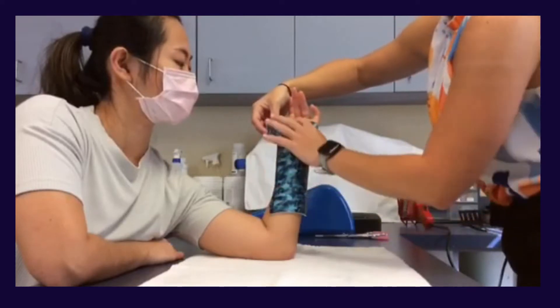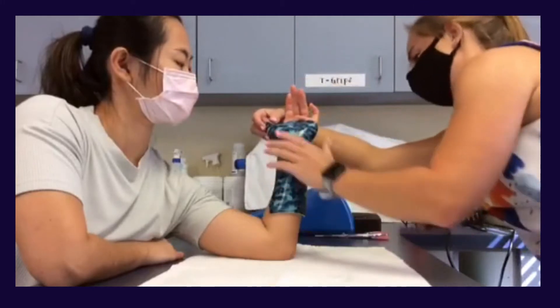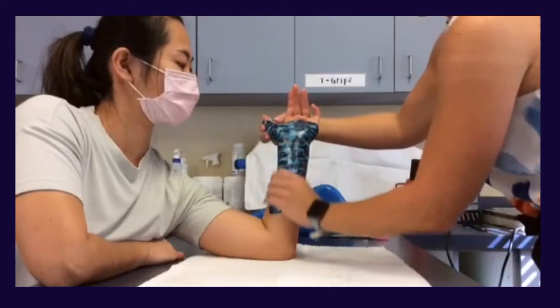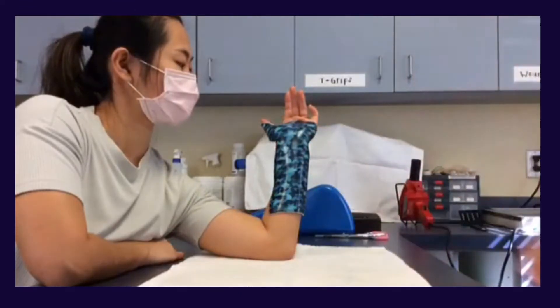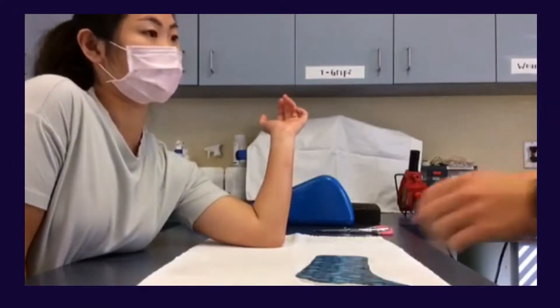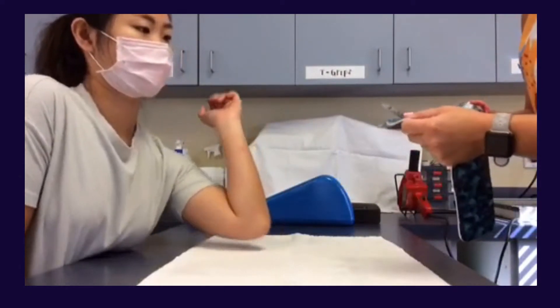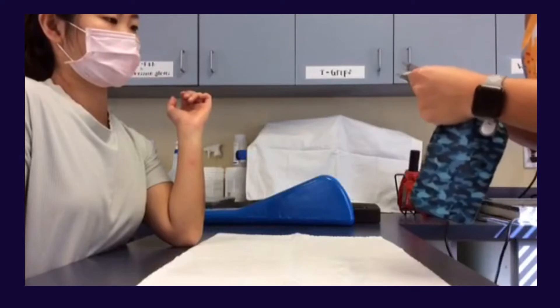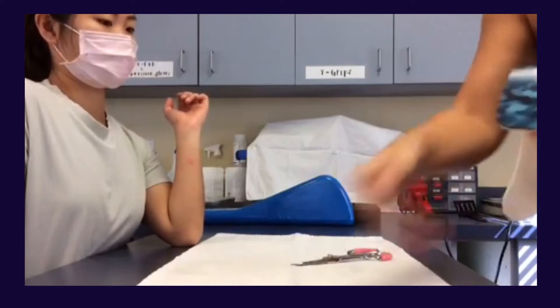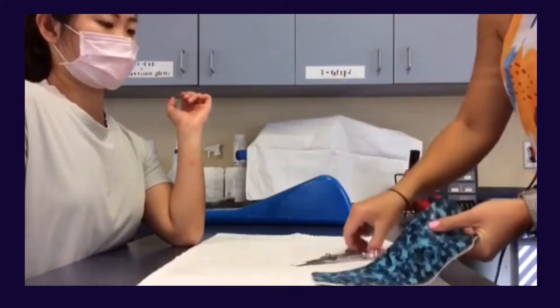Pull the thermoplastic material around the thumb into a loop while making sure the IP joint is free from movement. You can stick the two ends of the loop together or wait till the very end to make sure that you have made all of your adjustments prior to attaching the ends. As you continue to make your adjustments, make sure your edges are rounded to ensure comfort for the patient. Always make sure the material is not too hot before applying it back onto your patient, and the most important part of this orthosis is ensuring that the thumb has enough support.